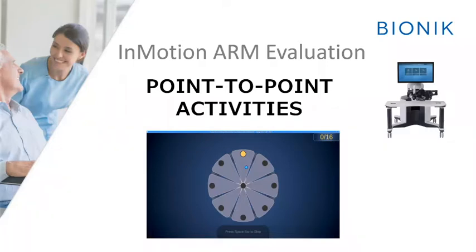When the activity is opened, the arm robot positions the pointer to the center, and the patient then uses their arm to go to each one of the lighted targets that light up in yellow. After the activity is started, the patient moves the robot arm to each of the targets for 5 rotations around the circle, which gives us a total of 80 repetitions. This is done without robotic assistance. This setup is used to further break down the area of the circle where deficits might be present so that the therapist can use the information to determine limitations into specific directions of movement.